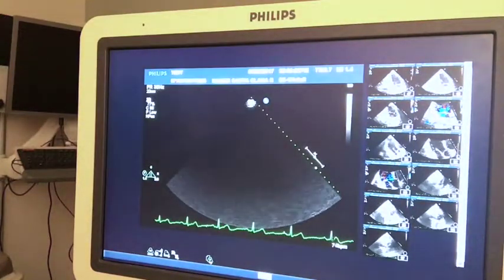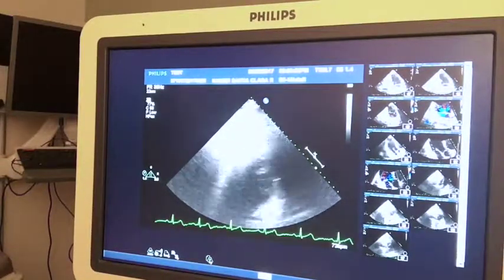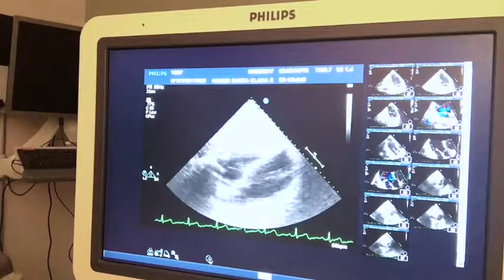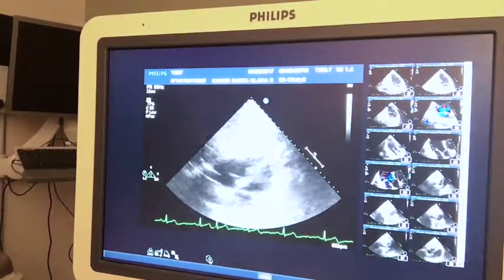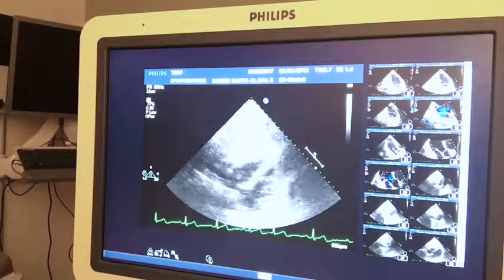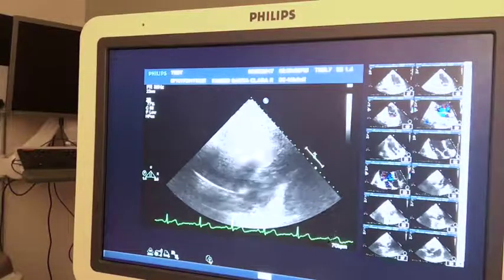Sometimes, also on the short axis, while we're here, when you're doing the sniff, just remember the easiest coaching you can give is mimicry. The best thing to say to the patient, especially if there's a language issue, or some kind of elder patient who isn't following you as fast as you're speaking, is to say, hey, in a moment I want you to copy me. I want you to do exactly what I'm going to do. I'm going to snort, and I want you to copy me when I tell you.